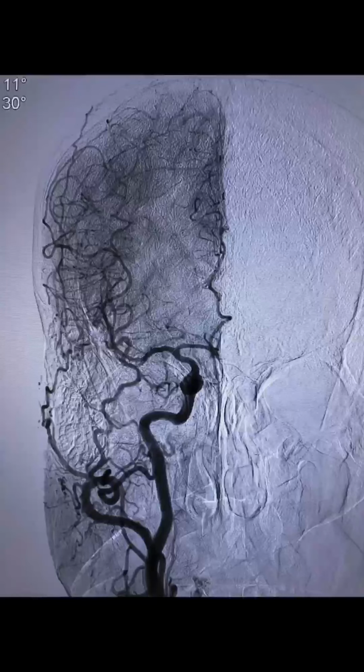So this is a very interesting digital subtraction angiography study which we have done today. So what is the advantage? What do you think was the main advantage? The main advantage was we have ruled out a significant stenosis. The patient does not have a significant carotid stenosis, so that part of the patient doesn't need any specific treatment. Second, we can decide the treatment. He needs to be evaluated by the ophthalmologist to decide what treatment is to be done for the retinal occlusion. The circle of Willis is incomplete, but he does not have any significant vessel stenosis, so it may not be significant at this moment.